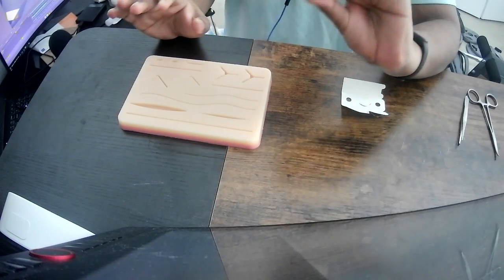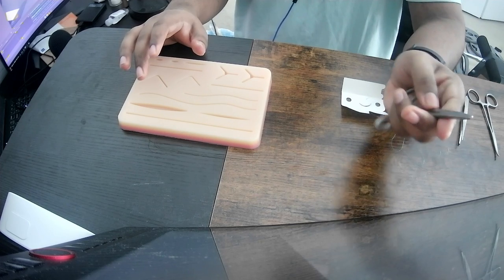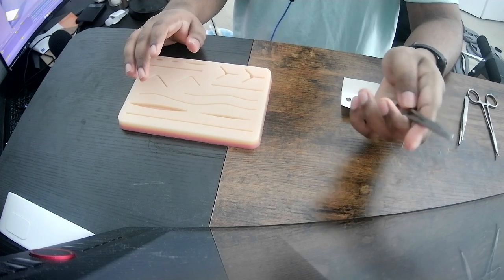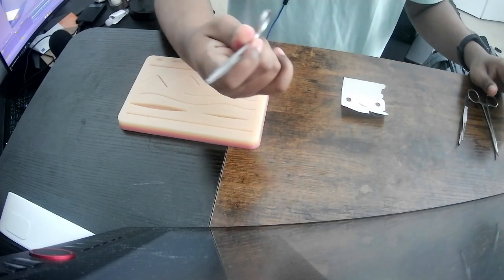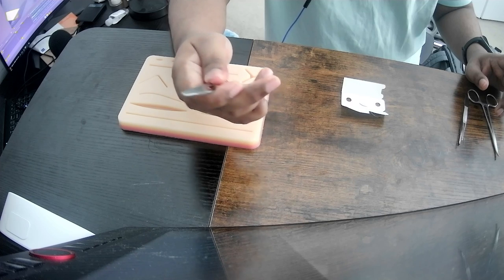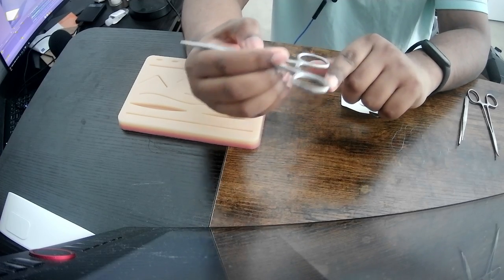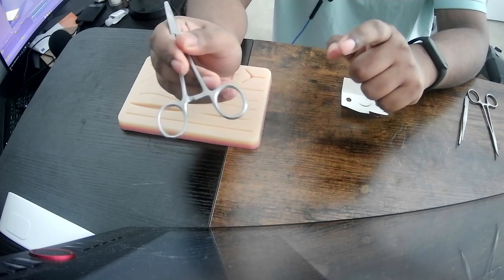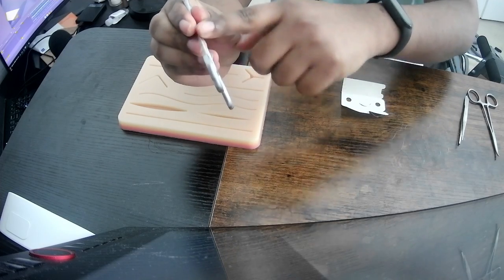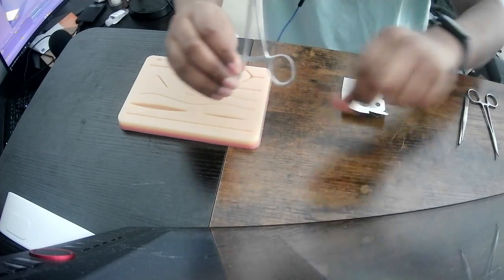I have practiced using the needle driver with both hands. We are expected to open the locking mechanisms one-handed. Left hand, I have some trouble. I think there's an easy way. Oh, no, not like that. Okay, right hand is fairly easy. Okay, let's see. You basically put force in the opposite direction of the serrated teeth. So the teeth are facing downwards, right? For this handle, the teeth are facing down. So I push it apart, basically. Push it apart.